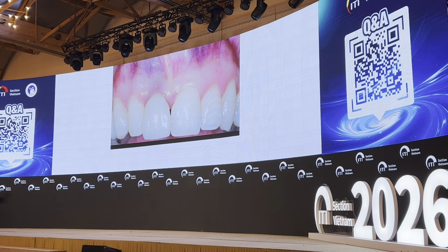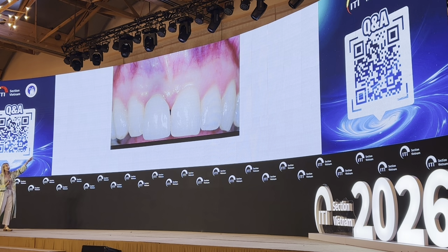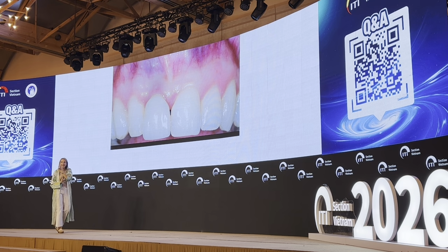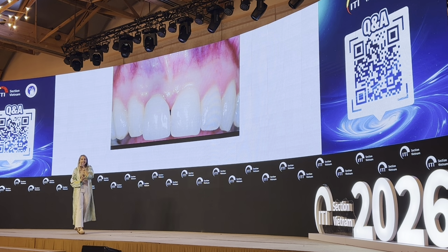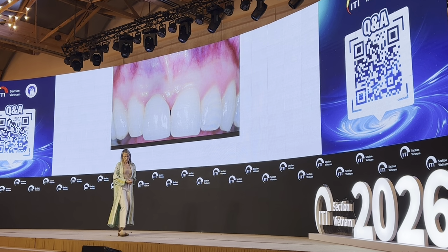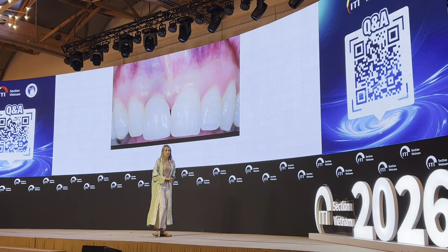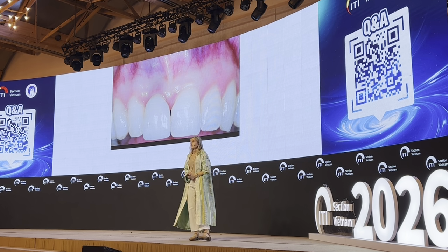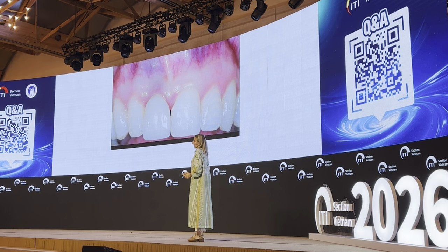And if we have a good amount of interproximal soft tissue, like in this case, in which, as you can see, we have a class 1, because we don't have an apical shift of the mucosal margin, but we have the lack of soft tissue thickness that creates this area of gray, which is the metallic that is visible through the thin alveolar mucosa. This is not a big defect, but it's something that the patient doesn't like.